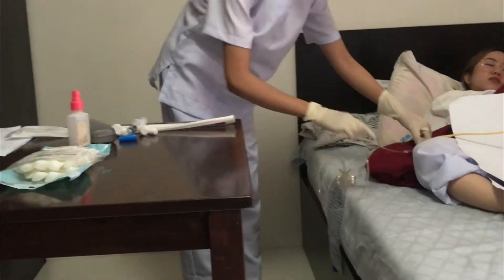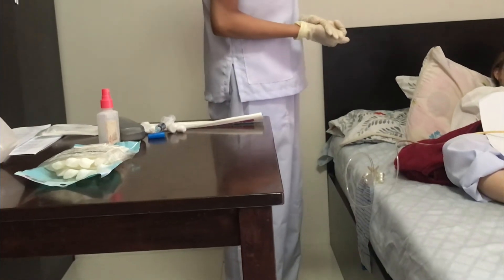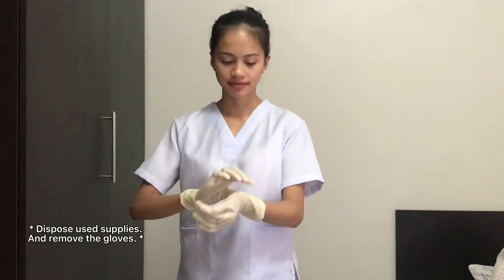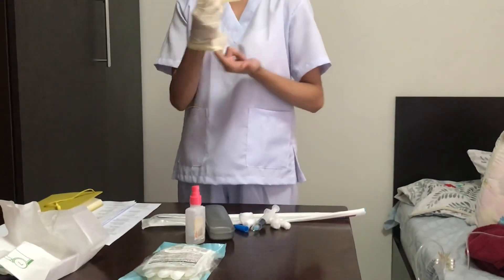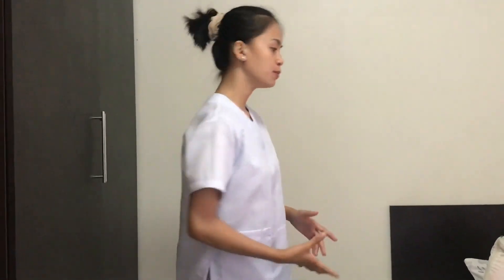Ensure the tubing is not kinked and secure the drainage bag to the bed frame below bladder level. After the procedure, dispose of all used supplies and then remove the gloves. Assist the patient into a comfortable position.